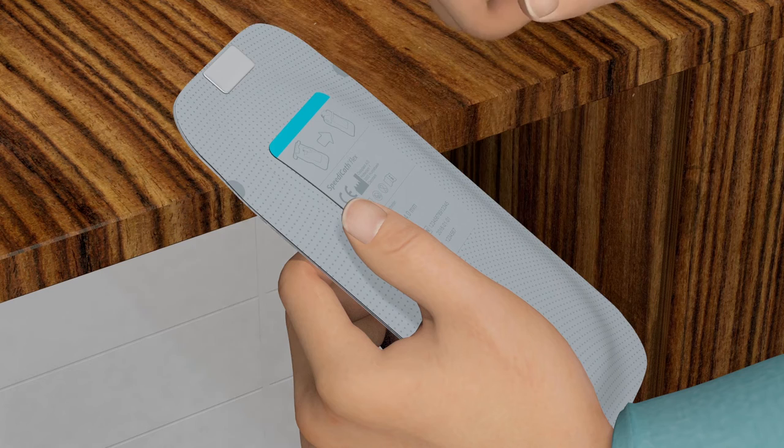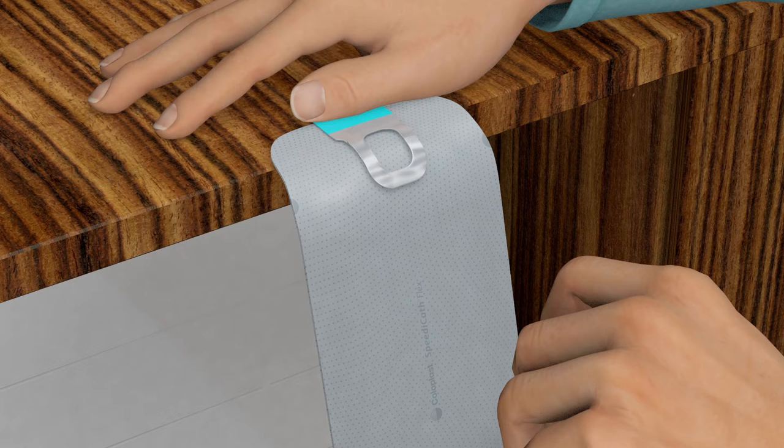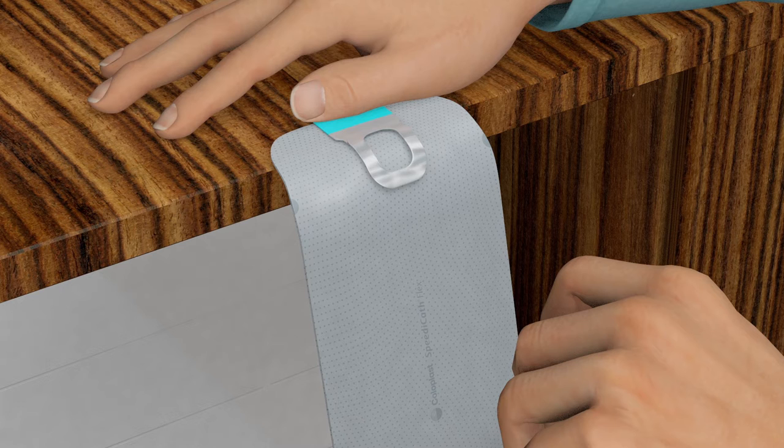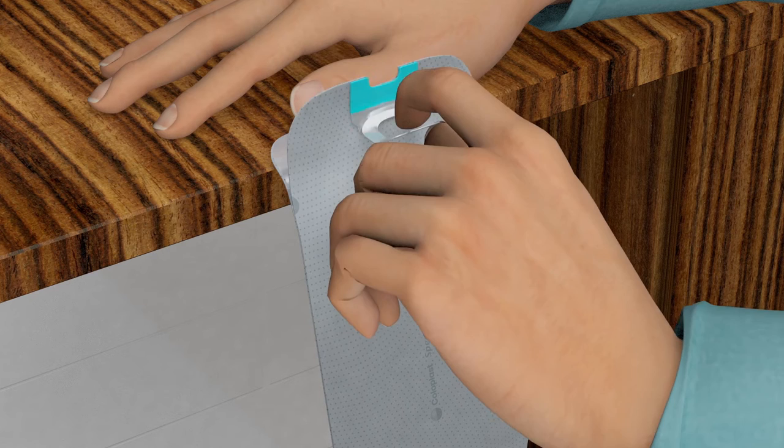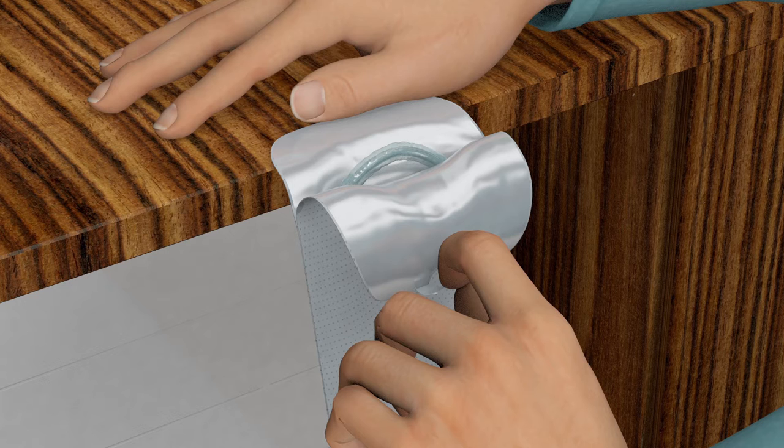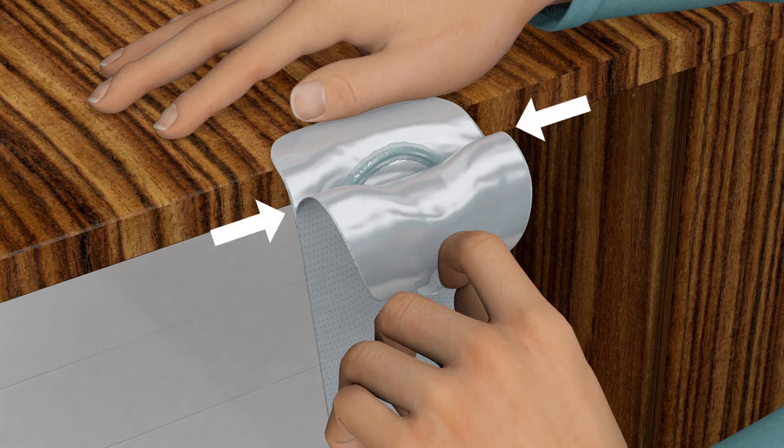Remove the cover label from the adhesive spot. Then attach the adhesive spot to a clean surface. The packaging must hang so that you can easily reach it when you are ready to use it. Open the upper end of the packaging by pulling the ring towards yourself and then downwards. You can also open the packaging without using the ring but do not open it using your mouth. Only peel to the tear stop indicated by the two grey dots.